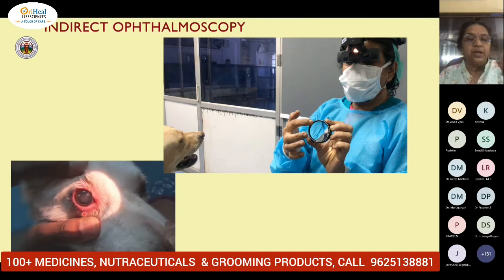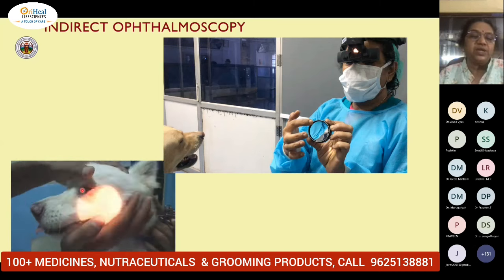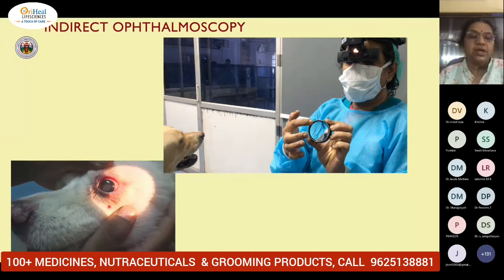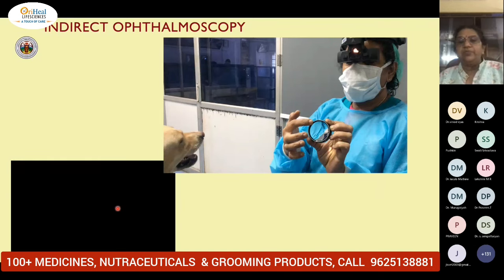So what is the idea here? The interposed lens, the eye, and the examiner's eye should all come in line. Then you will be able to examine the eye.